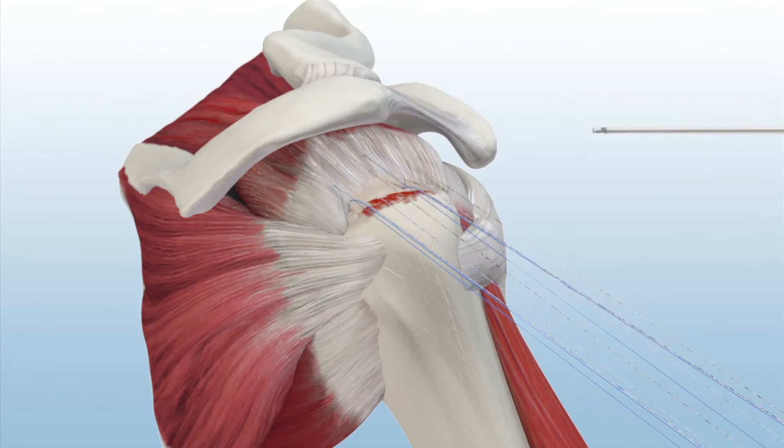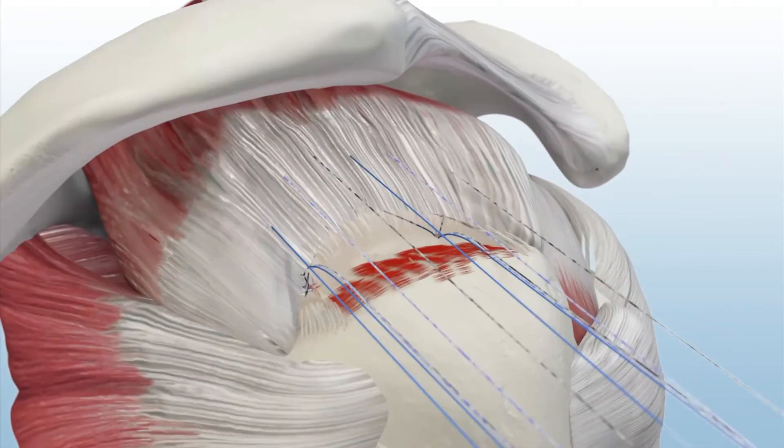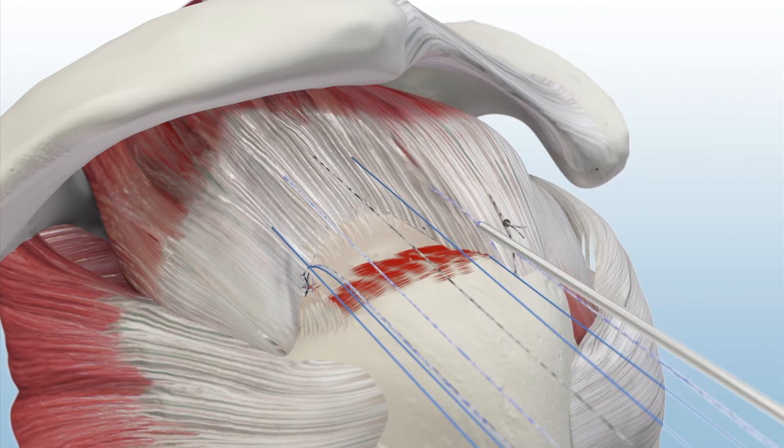After passing six simple stitches, sliding knots are tied from anterior to posterior to secure the tendon to the bone. Suture tails are cut with the Katana Suture Cutter.